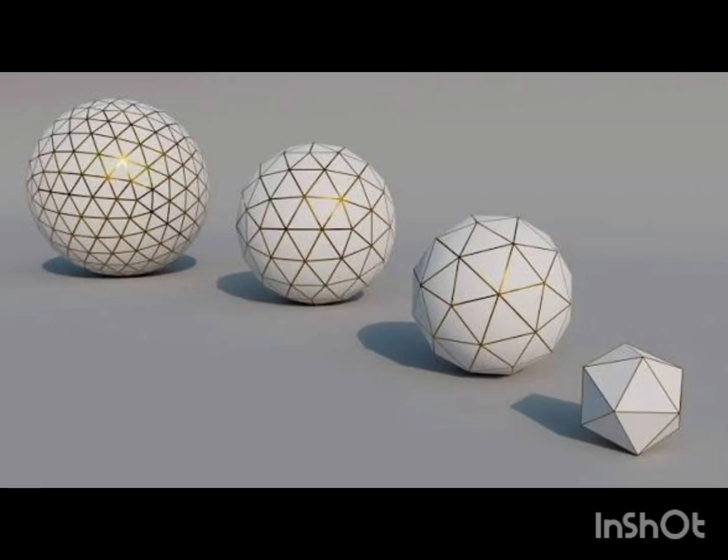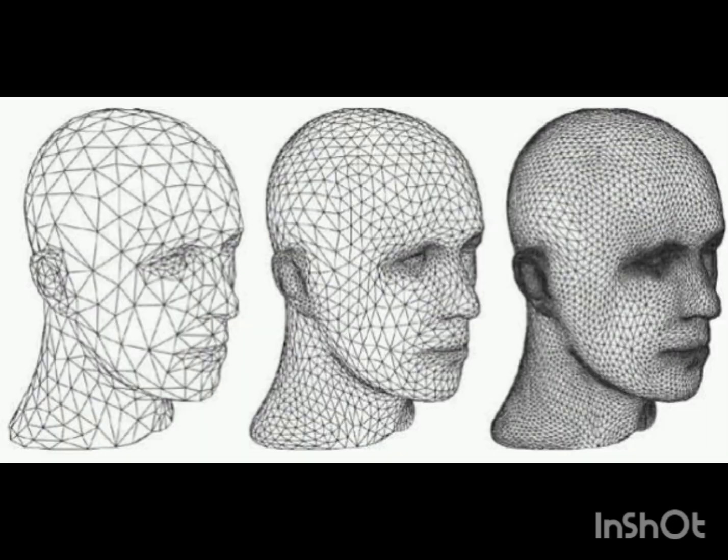Remember that an inaccurate scan produces an inaccurate STL file, which ultimately affects the fit of the aligner. So it is important that the digital impression, or the scan, should be carefully inspected before it is converted into an STL file.